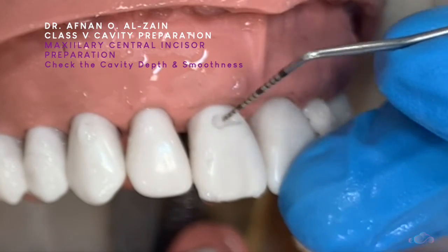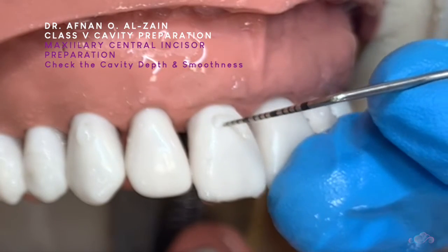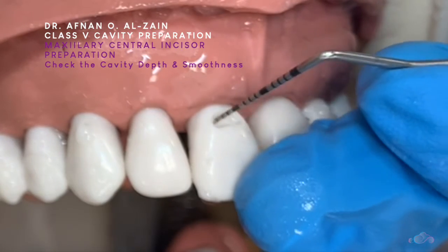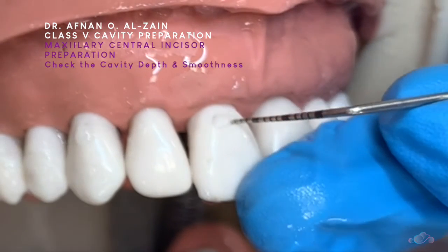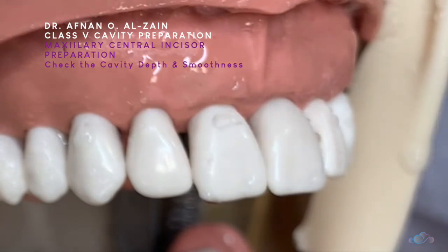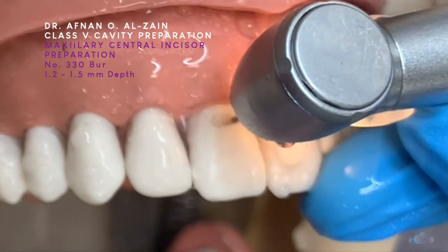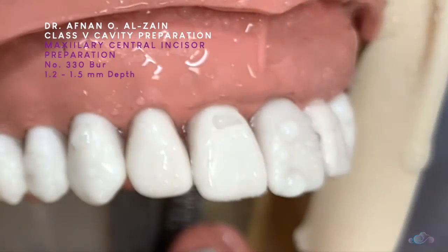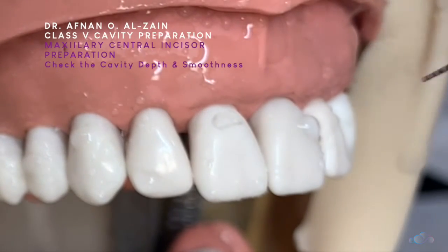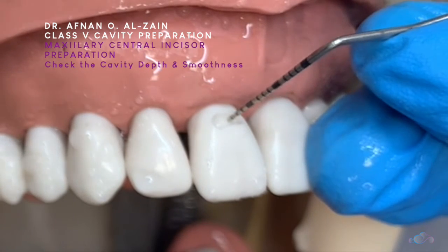We'll go back and check. The floor is smooth and even depth. 1 to 1.2 here at depth. We're going to go and increase the depth. Now we'll check again — the depth is approximately 1.2.